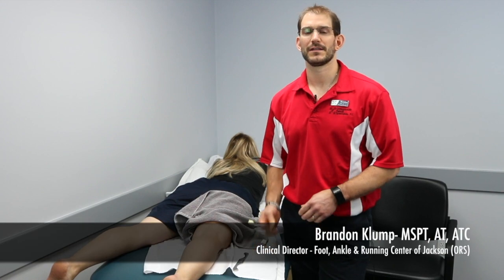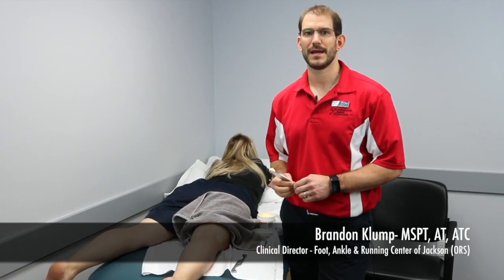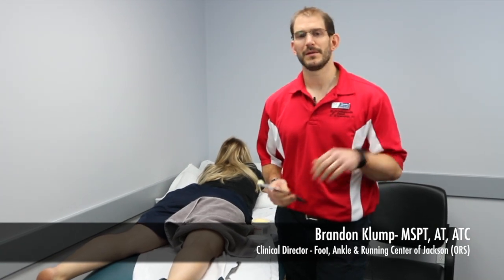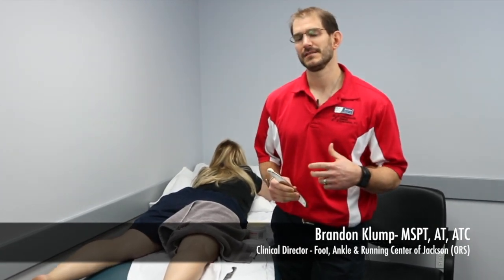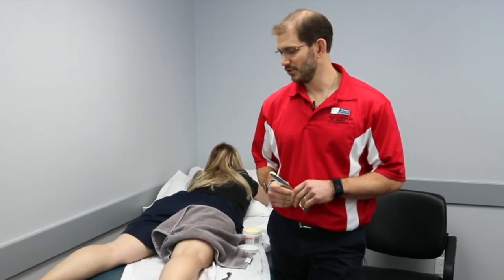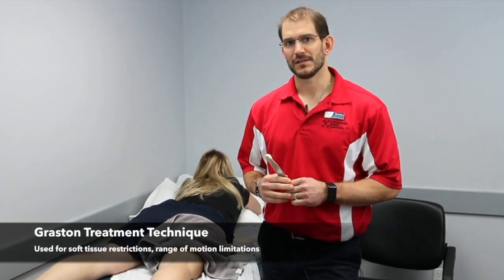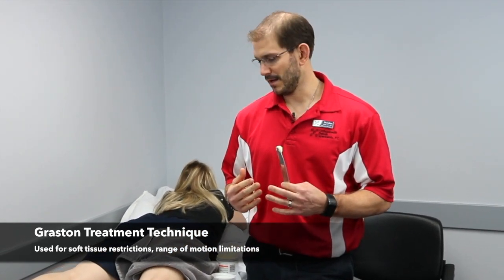Hi, my name is Brandon Klump, I'm the clinical director at Orthopedic Rehab Specialists Foot, Ankle and Running Center. Today I want to talk about what Graston treatment is — it's an instrument-assisted soft tissue mobilization. We utilize it on a wide variety of patients, pretty much any time there's soft tissue restriction or range of motion limits.